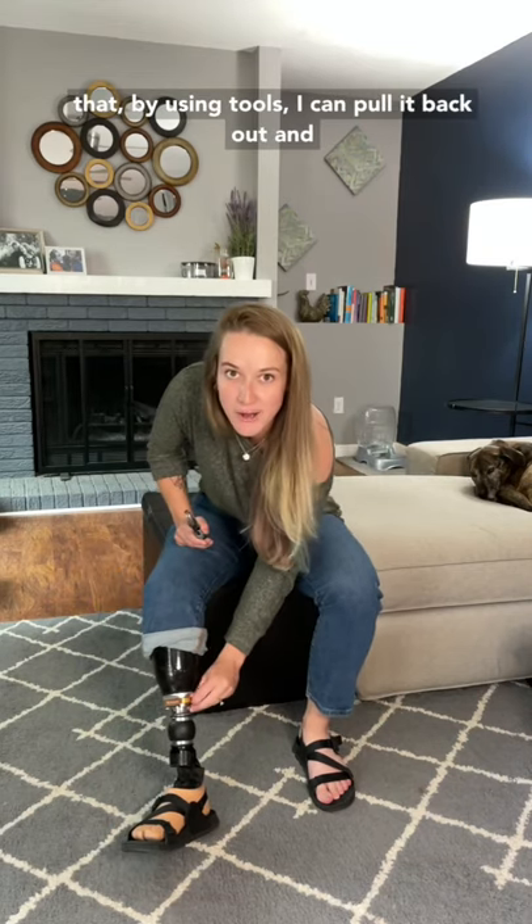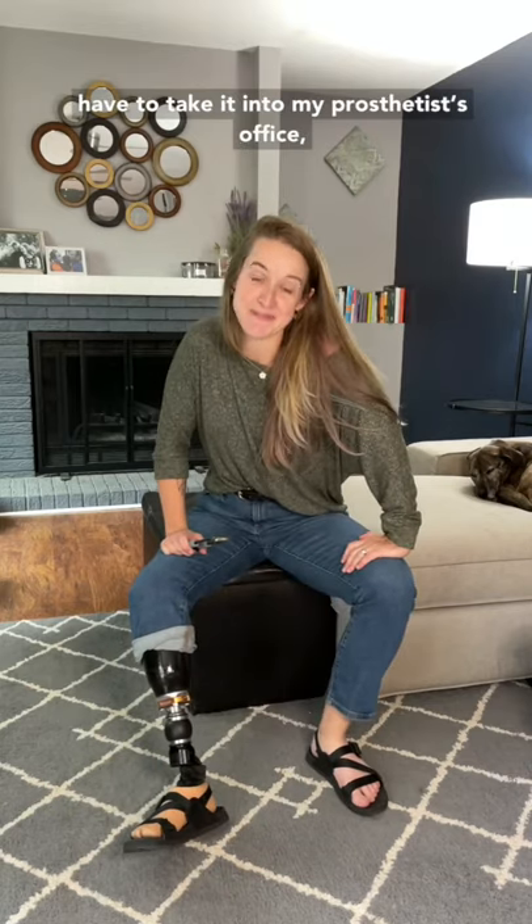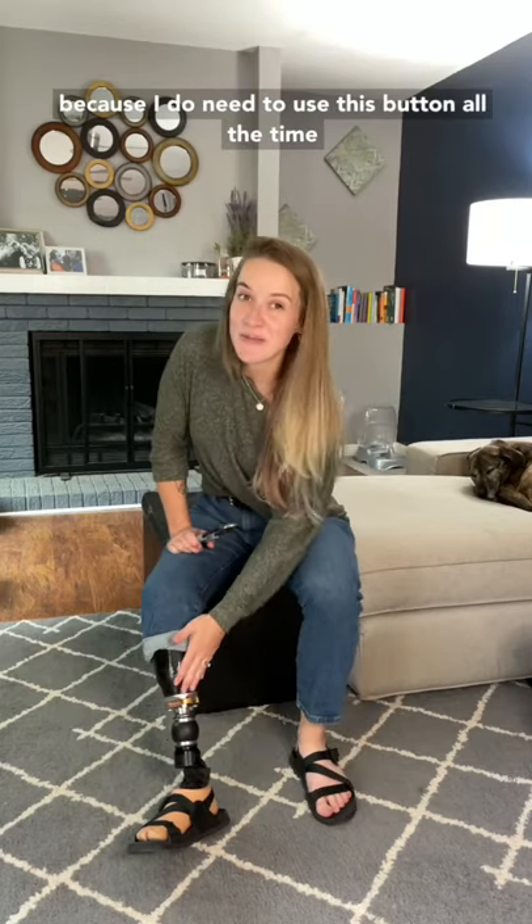I was able to discover that by using tools, I can pull it back out. We have a temporary fix; however, I'm going to have to take it into my prosthetist's office because I do need to use this button all the time when getting my leg off and on. But for now, temporary fix.